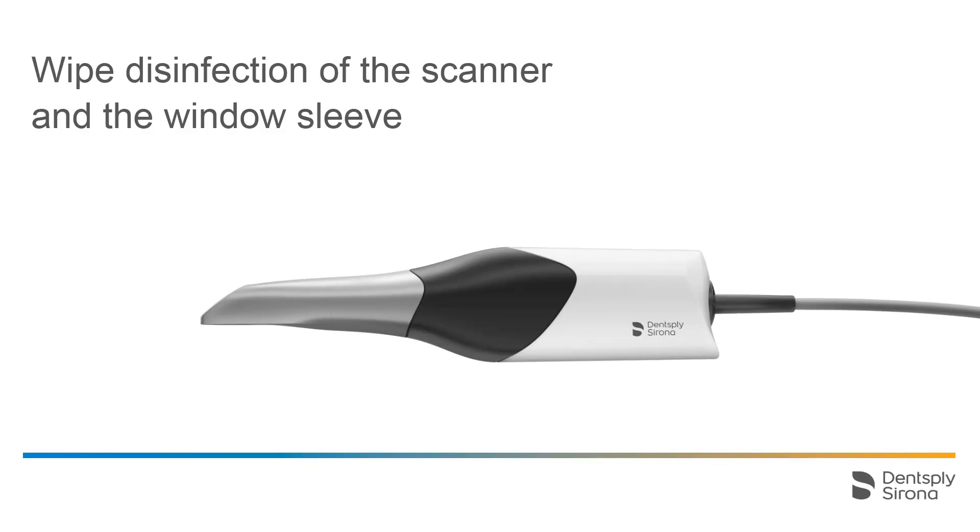We will take a look at the wipe disinfection of the scanner and the sleeve. The scanner is a highly sensitive optical device and must be treated with utmost care. Therefore, it should neither be sprayed with nor immersed in any cleaning agents or disinfectants.